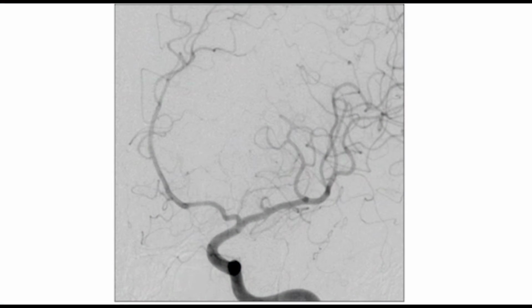This is a left internal carotid artery angiogram performed shortly after the time of a patient's presentation with a subarachnoid hemorrhage. This angiogram is considered the patient's baseline study. Note the normal caliber and configuration of the vasculature. The caliber of the vasculature in future angiograms will be compared against this baseline.